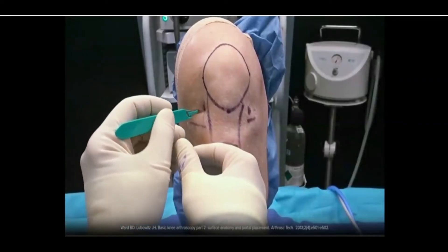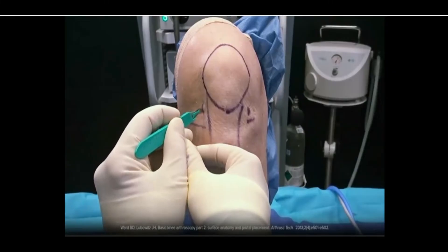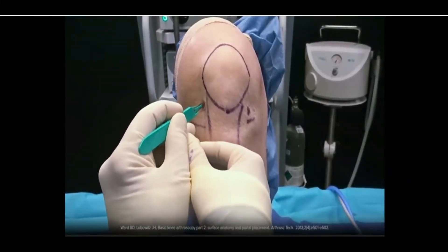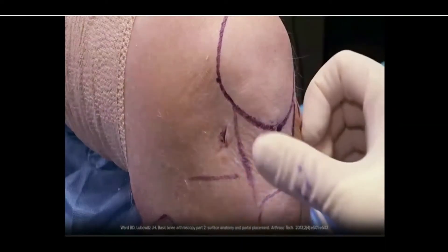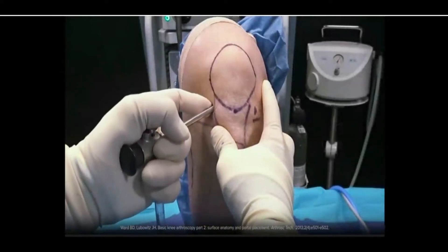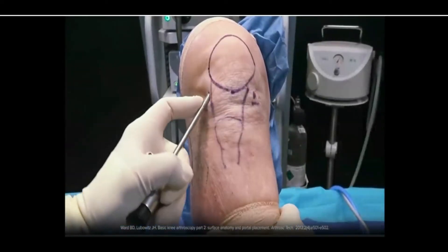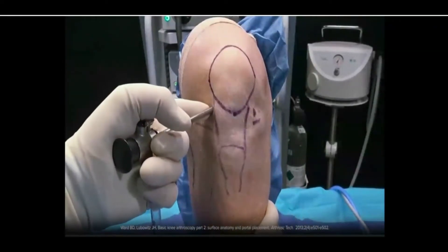When making vertical portals, it is important to keep the sharp edge of the scalpel facing upwards, away from the anterior horn of the menisci. Using caution not to injure the articular surfaces, gently insert the scope sheath and trocar into the joint space.